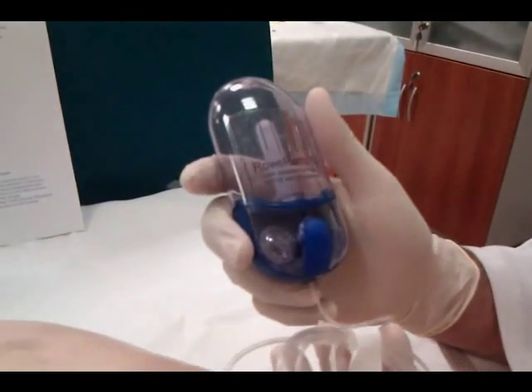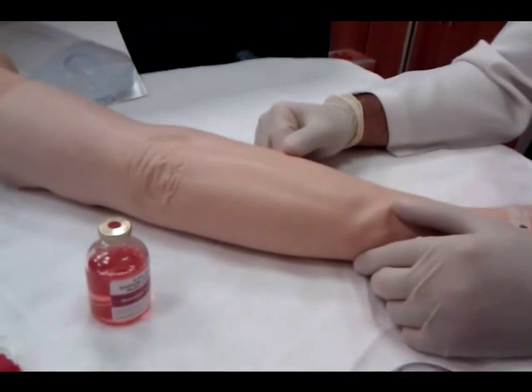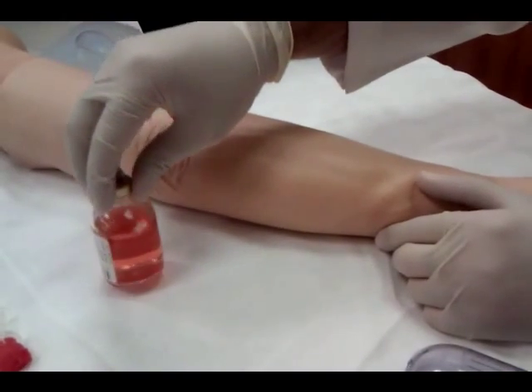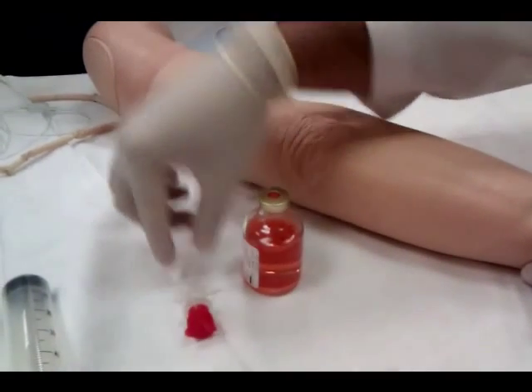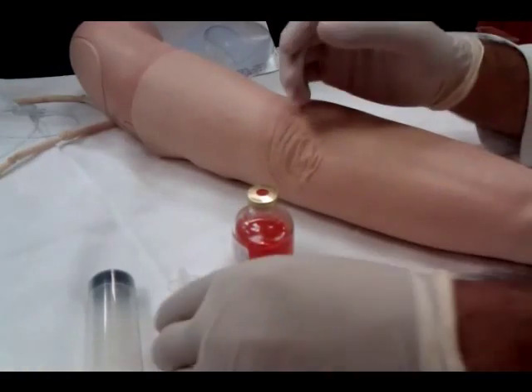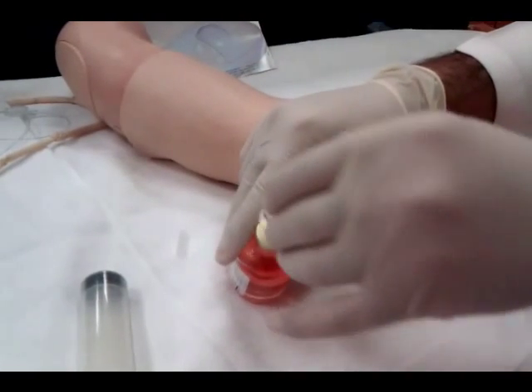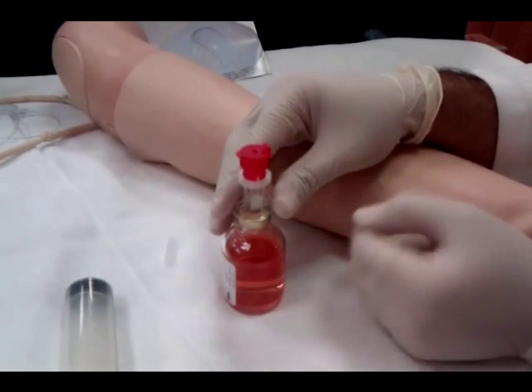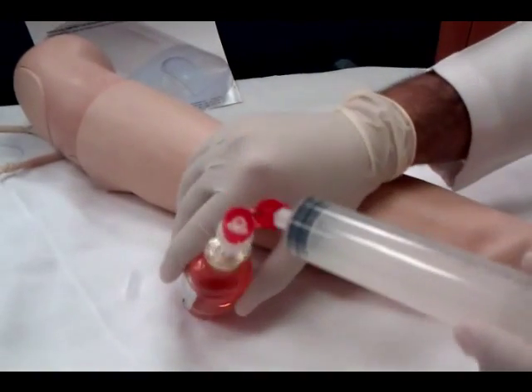Now let me show you how we fill the Rowe Pump. How to prepare and use the Rowe Pump. First of all, you should have the medication, the special connector here, I will show you how to use it, and a 60 ml syringe with Luer lock. First of all, you uncover the special connector and then you apply it using universal precautions to prevent any infection to the medication or the fluid, and you uncap the connector.